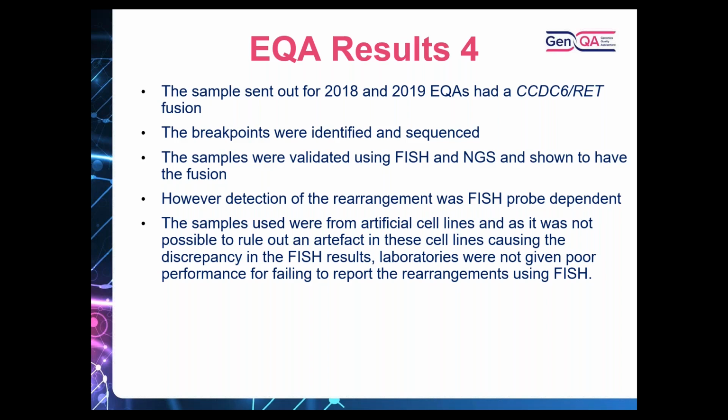However, it seemed that the detection of this rearrangement was FISH probe dependent, because particular FISH probes were unable to detect the fusion.